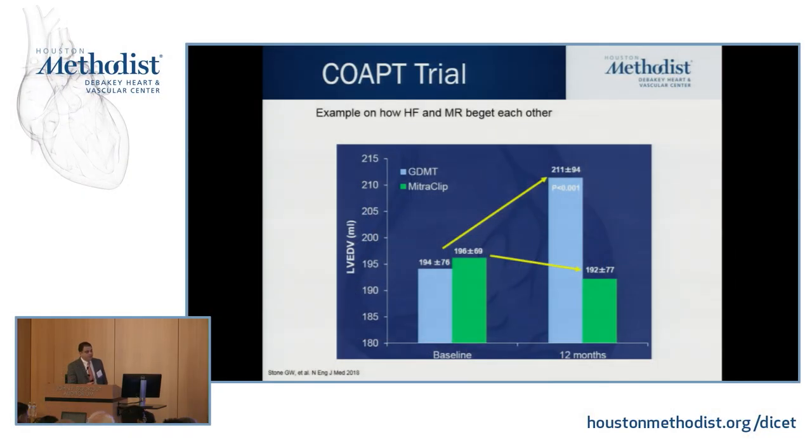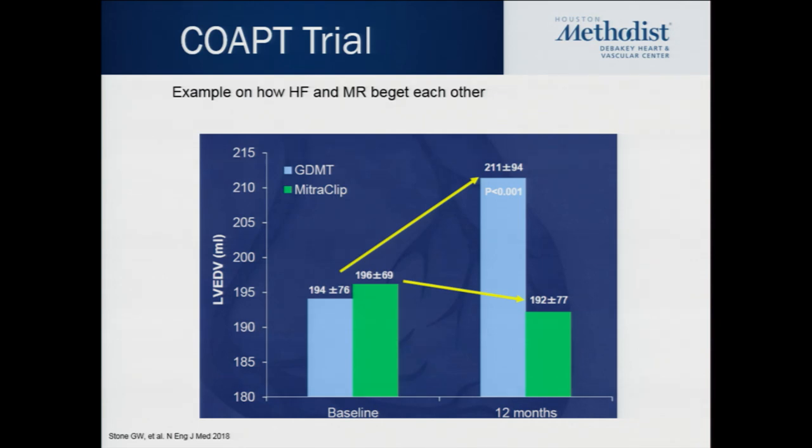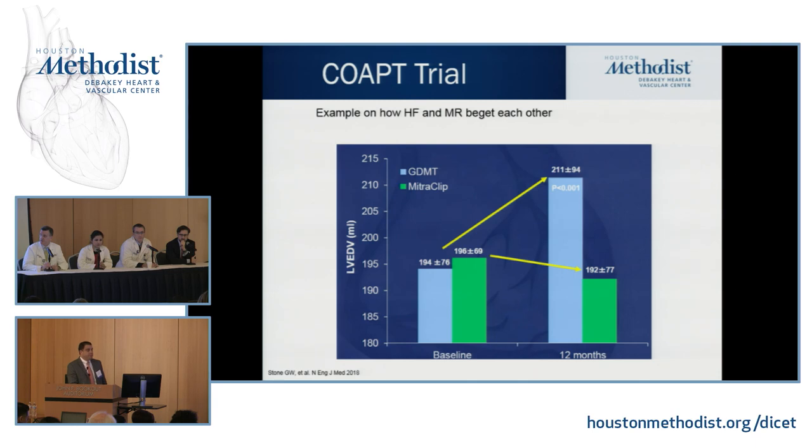And here's just the last part of that trial that I want to talk about. Initially I talked about medical therapy, and as Dr. Little said, there's reverse remodeling with heart failure therapy. But here, as they showed in the study, at baseline, the LV size in the medical therapy group, that is the blue, increased. But the size of the ventricle in the patients that got the clip clearly reduced. So there's now a hypothesis-generating idea that the device also has remodeling or reverse remodeling effects. The same thing happens with mitral valve surgery. Yeah, but for the patients that are not. Right. So I think time will tell.